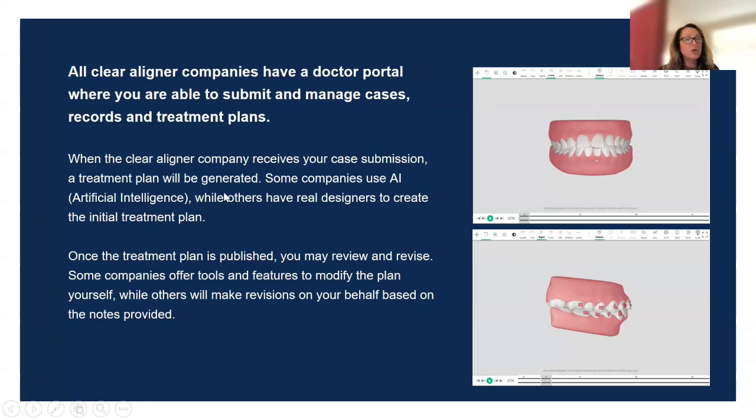Does that part make sense? Just because the aligner company says this is what you're going to get, is not necessarily what you're going to get. You can change it. Make sense? On that, any questions for that part? None right now. Okay, so let's say everything looks beautiful. I love that treatment plan. Go ahead and send me my aligners.